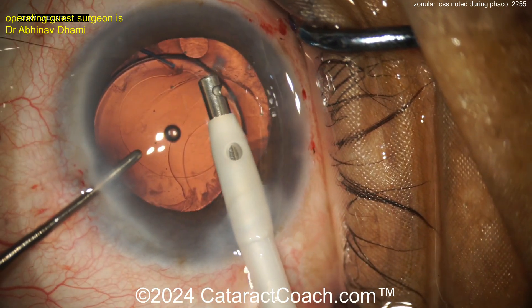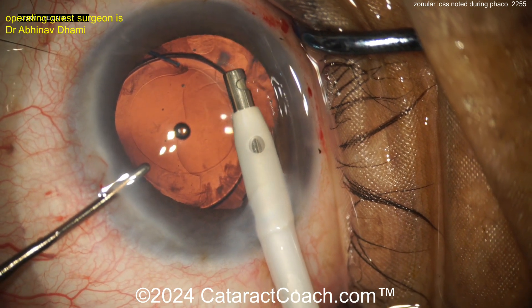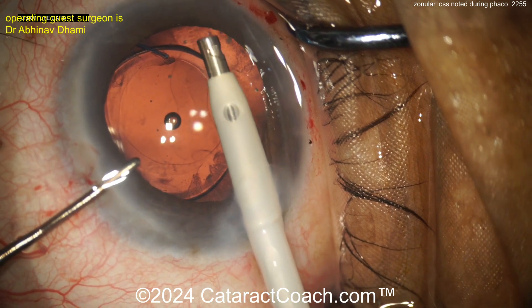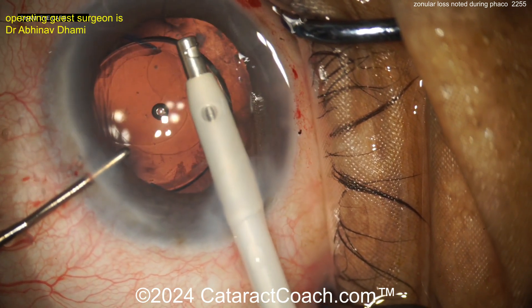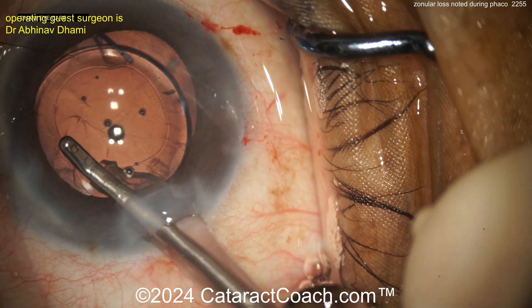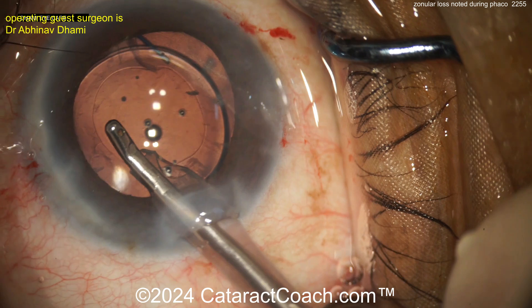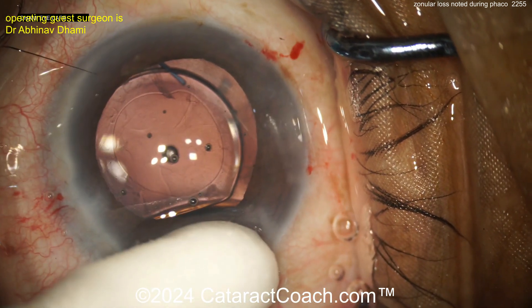Coming out of the eye lets it collapse — you don't want to do that. There's the vitrectomy being done. A little more triamcinolone can help stain that vitreous. I usually like a bimanual vitrectomy — I don't usually use coaxial. I've never seen a retina surgeon use coaxial, which is why I figured the bimanual approach was probably better. Taking this out — don't let the AC collapse. You may need to put something else to help support this, maybe a capsular tension segment, or suture to the sclera.